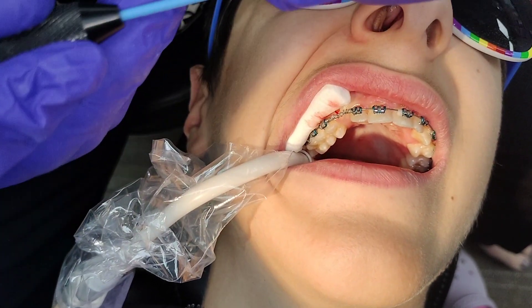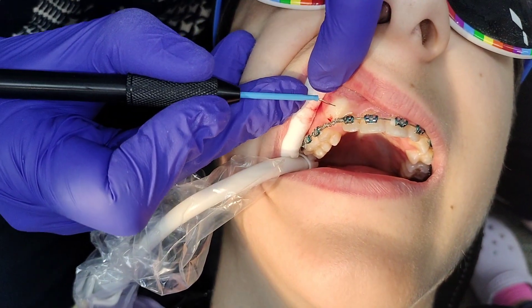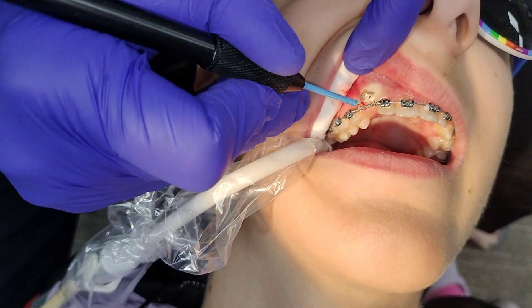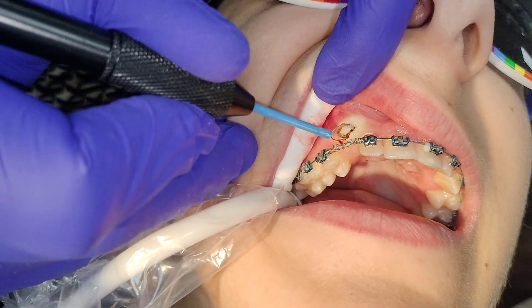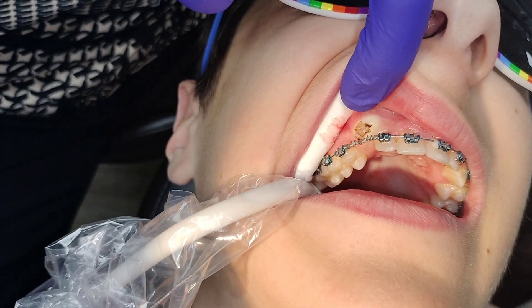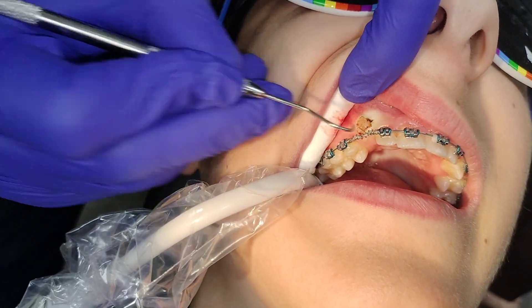All right, in action — we have an electrocautery here that is going to create a little window in the gum tissue. So we can see the shiny side.